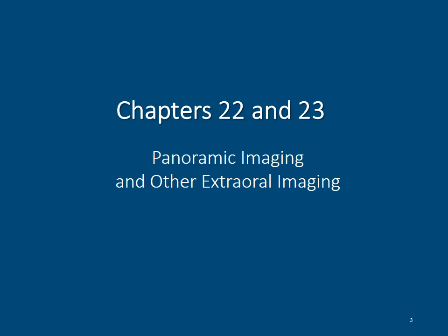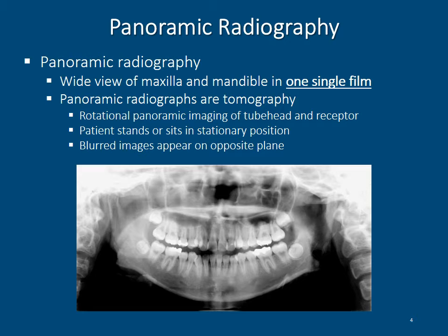Let's begin with chapters 22 and 23, panoramic imaging and other extraoral imaging. We spoke previously on panoramic radiography, and I showed you a panoramic film. This is a wide view of both the maxilla and mandibular arches in one single radiograph. Panoramic radiographs are called tomographies.